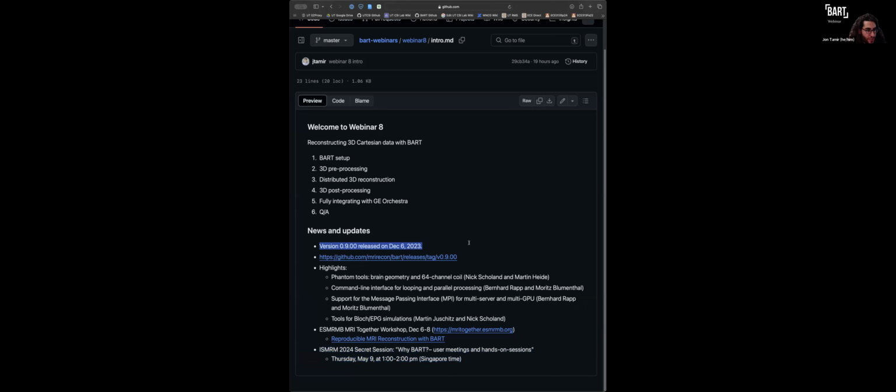We used version 0.9.00 today in the webinar. Check it out and see all of the various highlights of the changes. Most specifically, the Phantom tool has gotten better, and the ability to loop over dimensions is now built into BART.